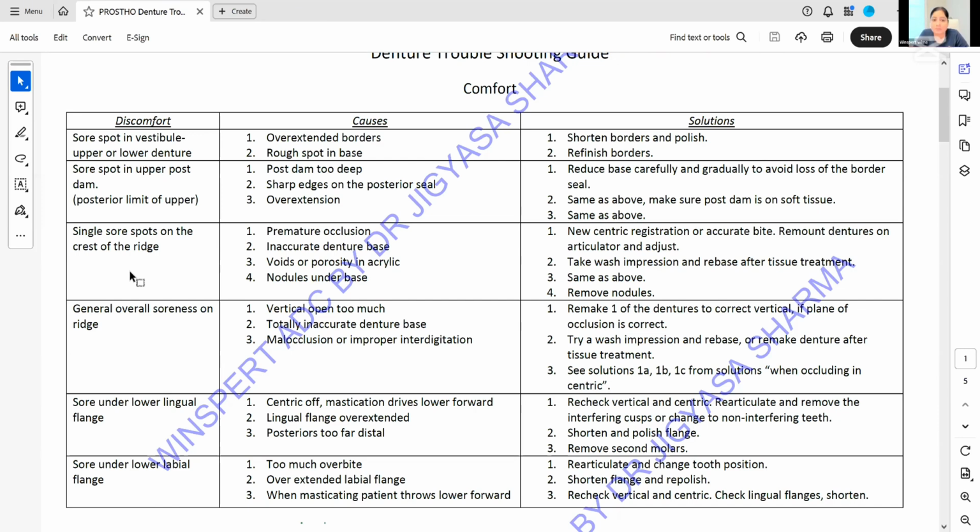You will see where the premature occlusion is happening, because a complete denture has to be in a bilaterally balanced occlusion. Everyone is familiar with the fact and has attended my full occlusion class as well, where I fully explained bilaterally balanced occlusion, right? When a complete denture is given, it is expected to meet bilaterally on chewing when you have lateral excursions or chewing movements, and one becomes your working side and the other is your non-working side.